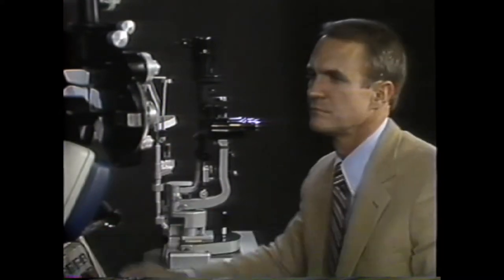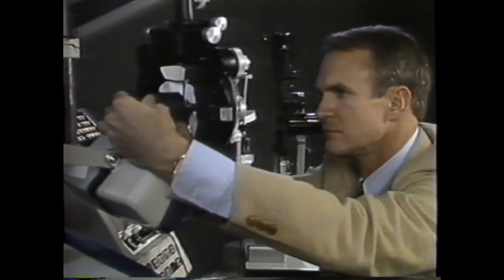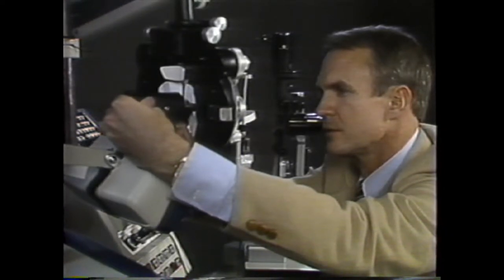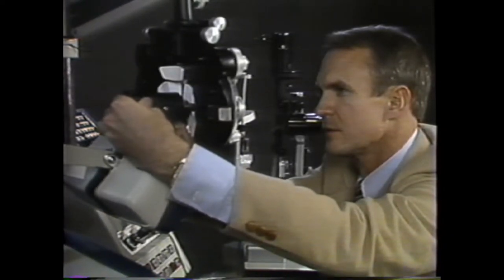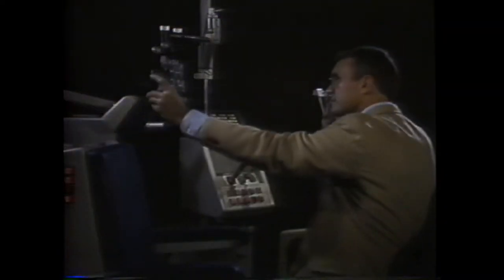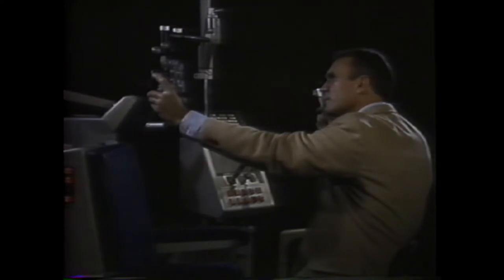Now it's time to retinoscope an eye with an unknown spherical error. First, set the schematic eye to an unknown spherical value without looking at the scale. Then position yourself at the normal working distance and dim the lights. Be sure to hold the sleeve on the retinoscope up and look for with or against movement. Here's with movement — we dial down to add plus until just a little with movement remains.